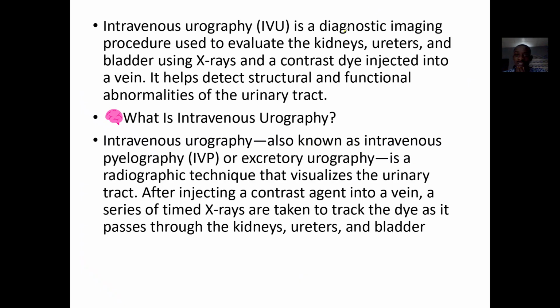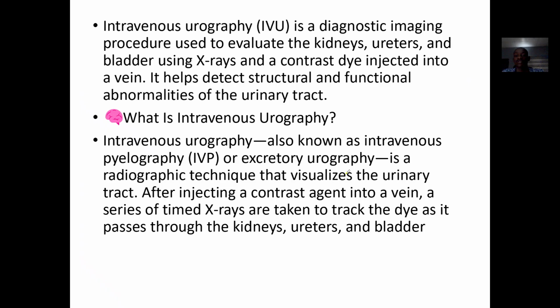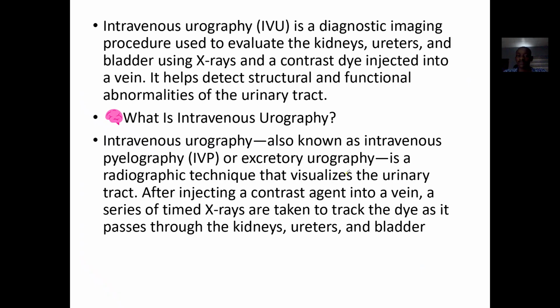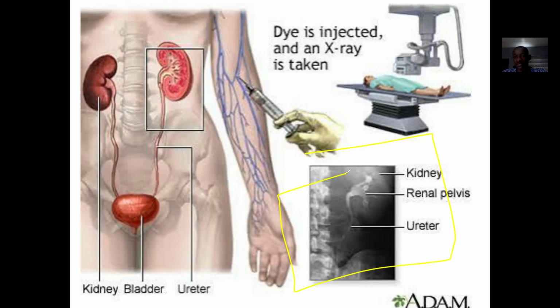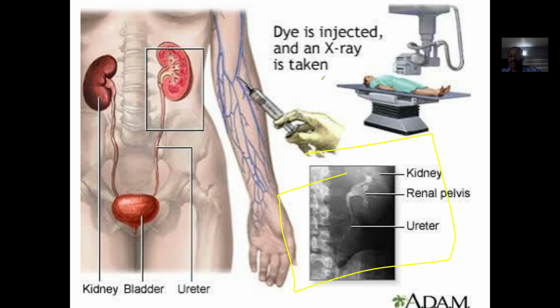So it's a diagnostic imaging procedure. It's used to evaluate the kidneys. So you can see in this picture right down here, you see the kidney, you see the ureters, the bladder, and they use x-rays for that. Okay, so it's a contrast dye. The contrast dye is actually injected into your vein.